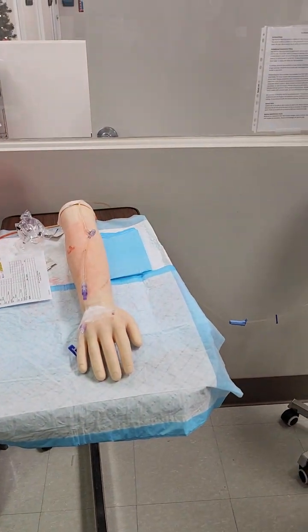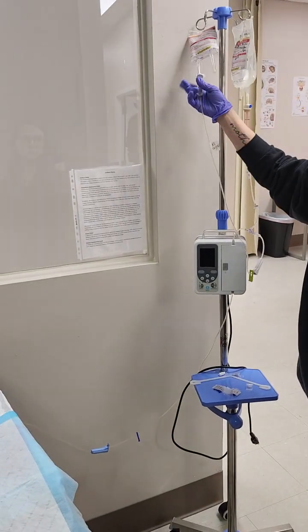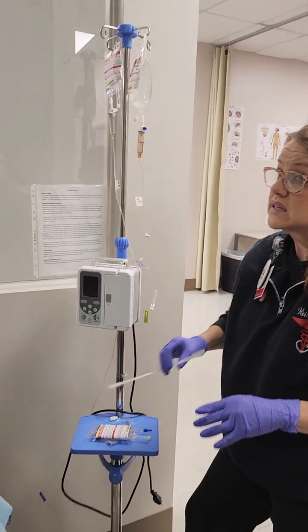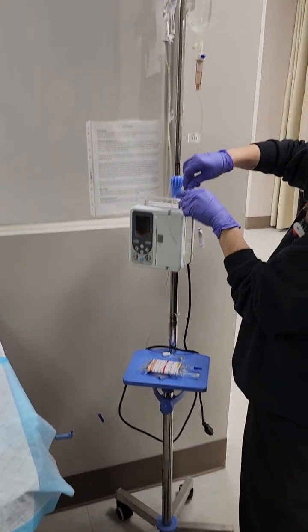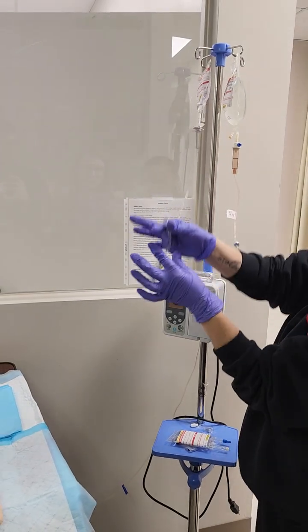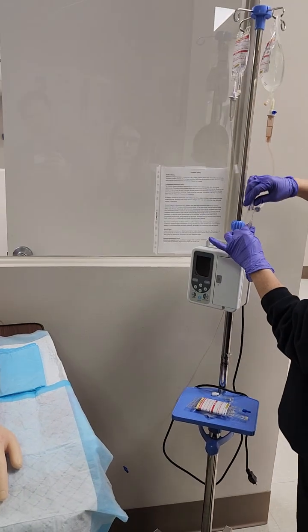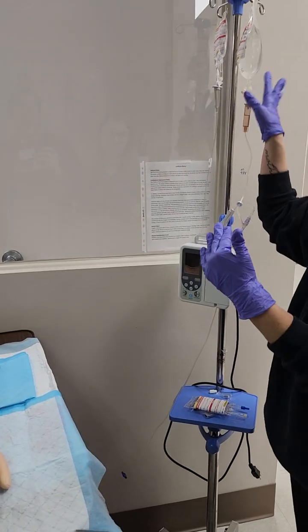Now we have to hang it as a piggyback. So remember, I have a primary infusion and I have a secondary infusion. This one's empty, so it's coming down, and I'm hanging my new one. Which one has to be lower or higher? Primary has to be lower, secondary has to be higher. And I can always tell. This is my secondary. It's way shorter than my primary tubing. My primary tubing is going all the way to my patient. My secondary tubing is shorter, and it hooks into my primary. So this one's secondary, it's piggybacked onto my primary.